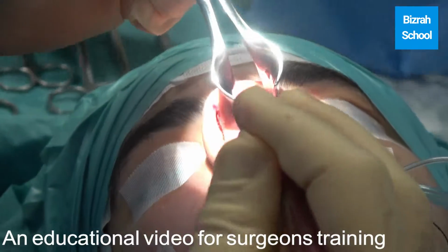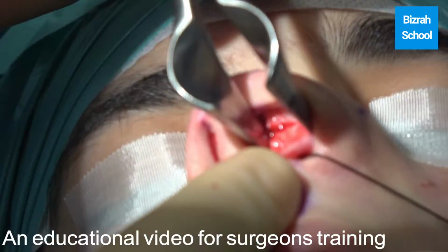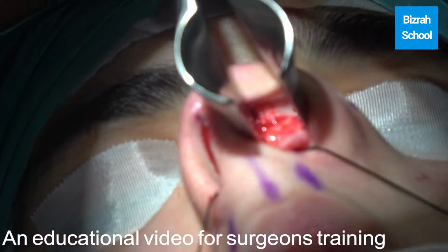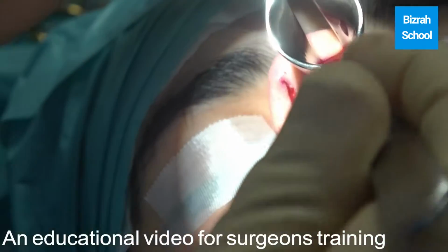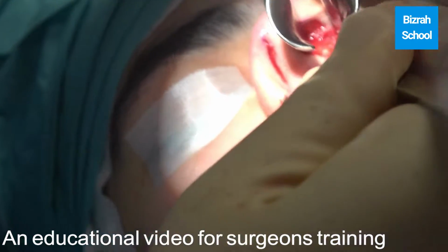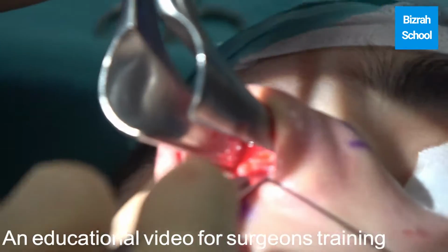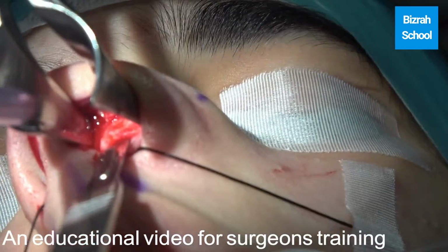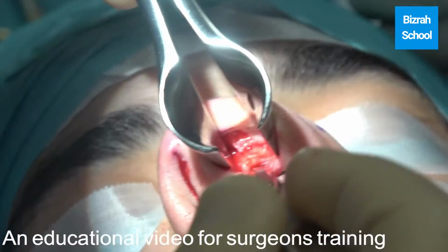You see, so we go to the lateral crus. You see the upper lateral cartilage very clear there, and we get a knife and we make an incision between the mucosa and the cartilage, because we want to go into a pocket. You see a pocket just under the cartilage. You see, under the cartilage and above the mucosa of the nose.